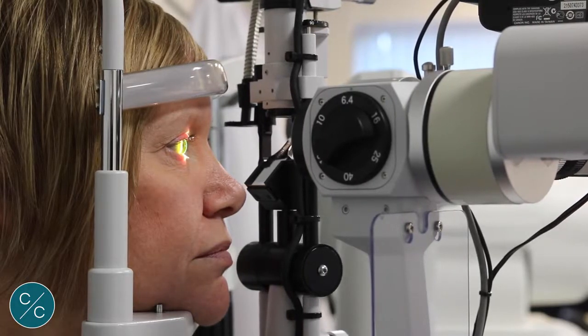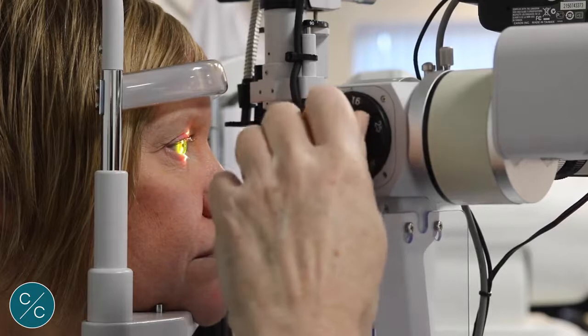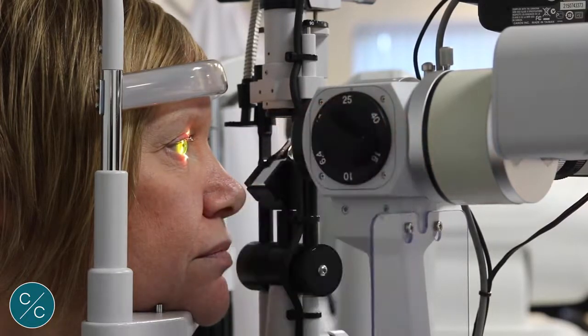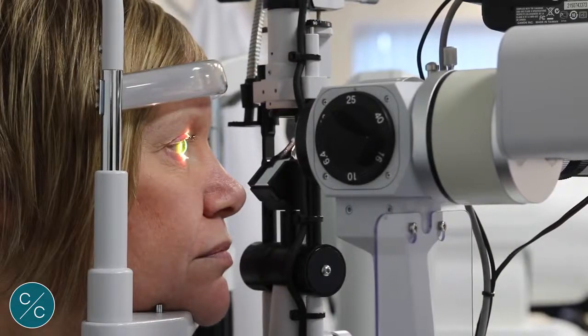Having got it in the best possible focus, I can then increase magnification and zoom in.